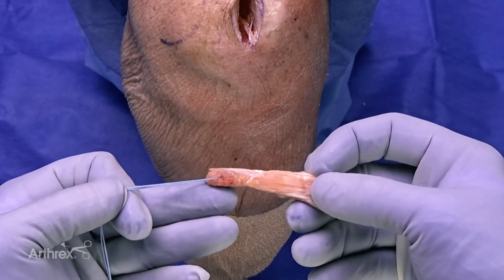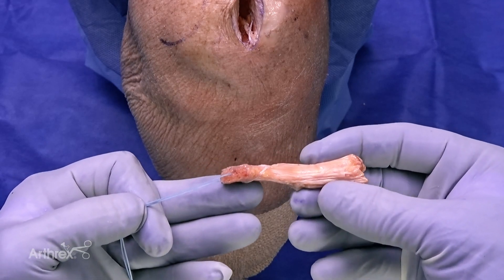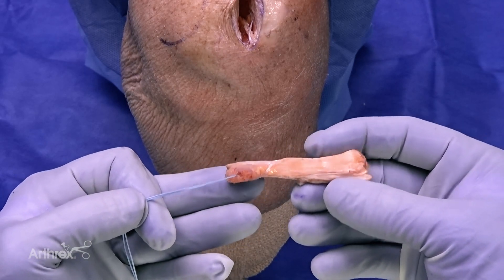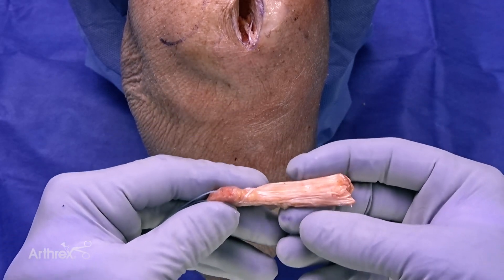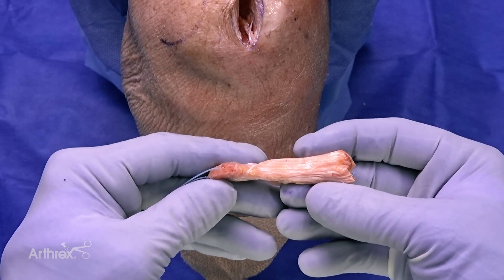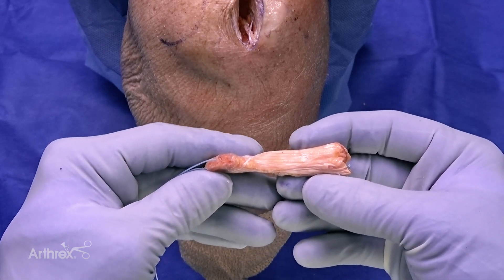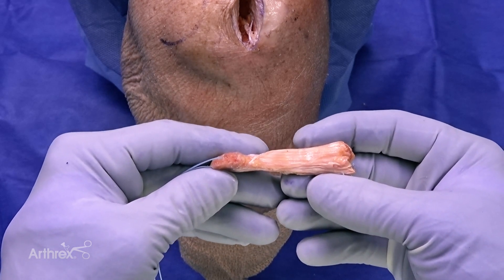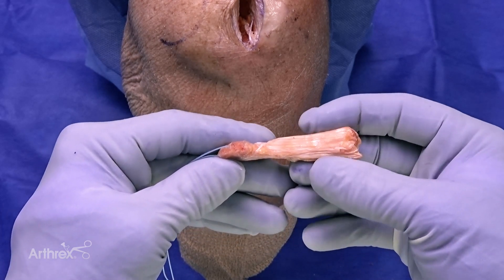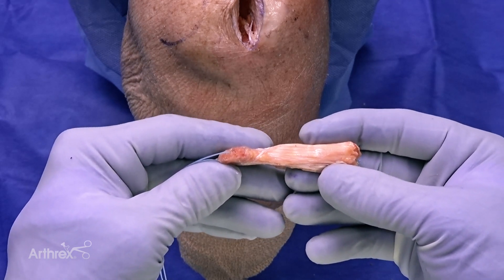We have our desired graft length and bone block. One of the unique and exciting aspects of quadriceps tendon as a graft choice is the amount of collagen we get. The advantage of this thick tendon is complete fill of our sockets during ACL reconstruction. Using the fiber tag tightrope implant allows us to get a tapered and tight fit so we do not have to sacrifice any thickness of our graft.